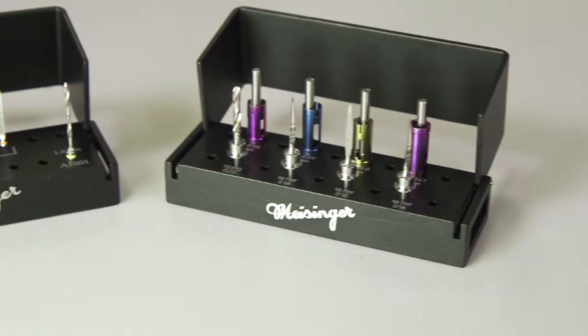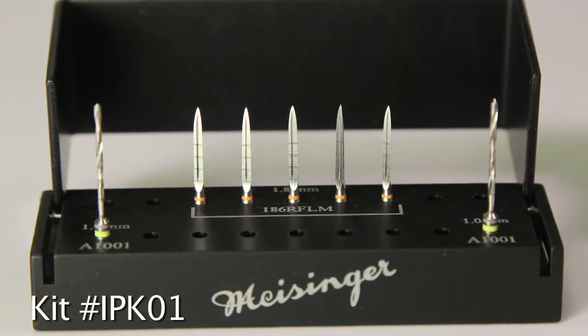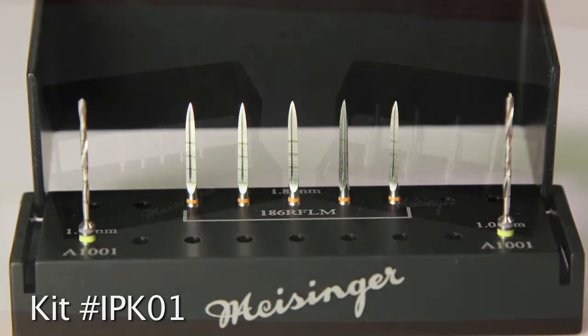Meisinger offers two fantastic kits for implant preparation. The first kit, the IPK-01, has two 1.0 millimeter drills and a series of five starter drills.